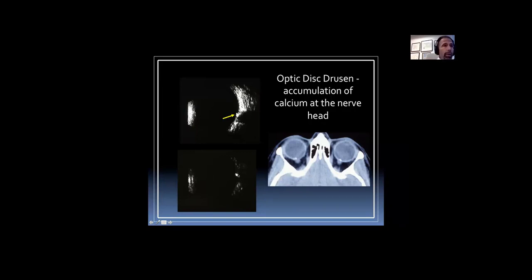And so in a patient who's got an elevated optic disc that might even look somewhat swollen, your suspicion of buried optic disc drusen can be confirmed with B-scan ultrasonography. Here's a patient that was sent to me. I did not order the CAT scan to diagnose the drusen, but you can see calcification at both optic discs. This person had a headache or something, and they said, oh, by the way, there's something going on at the optic nerves, and the patient was sent to me to figure that out. They had obvious optic disc drusen. I don't recommend CAT scan to diagnose disc drusen: it's too expensive, and you may not get a cut right through the optic disc, so do the B-scan ultrasonography.